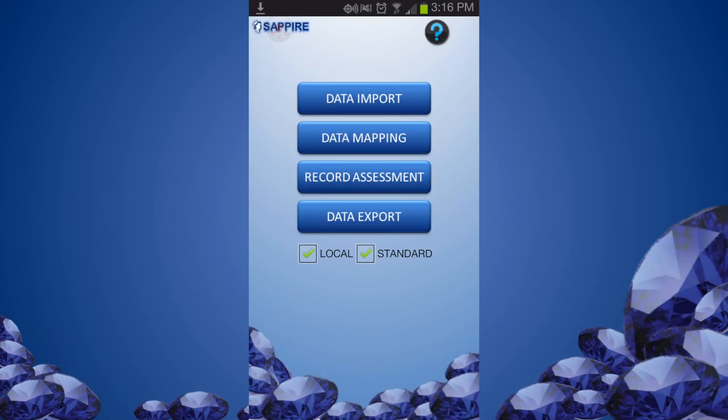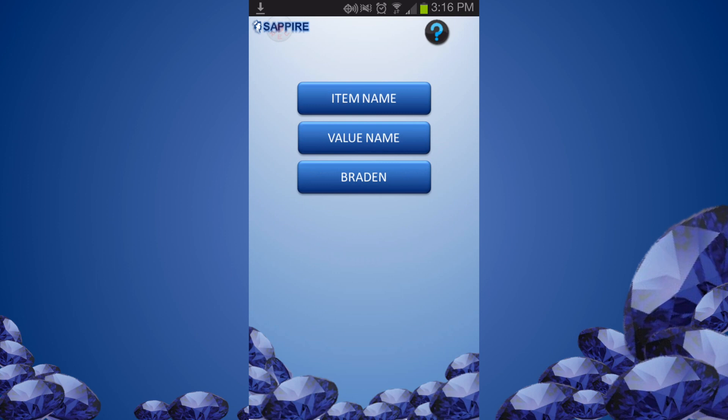Next we will map the local assessment items to the standard items to attach standardized concept codes. We can also associate assessment items to relevant Braden scale parameters in this tab. From the main menu, click Data Mapping.